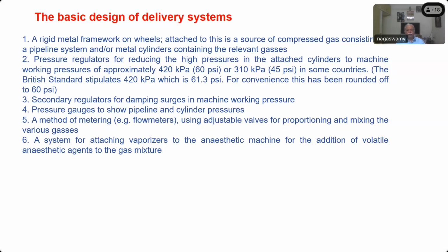No, sir. Interlock. Why are you taking so much time to answer this? You all know that you cannot deliver 2 gases at the same time, or the vaporizers of 2 different agents cannot be used at the same time.